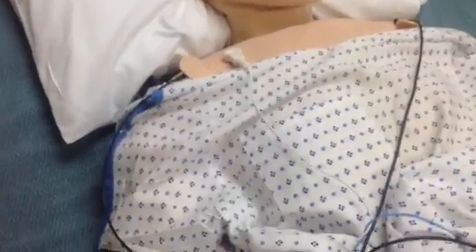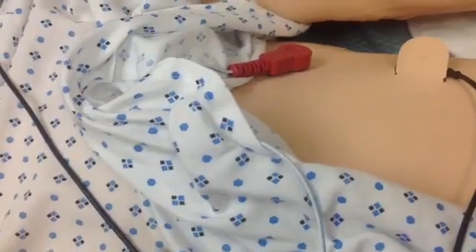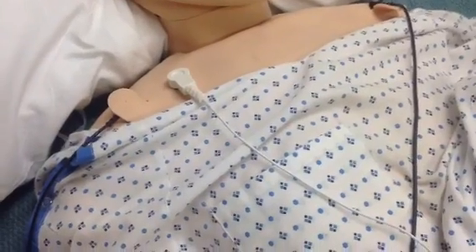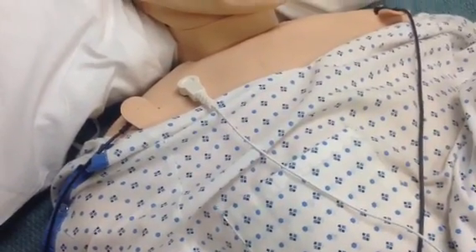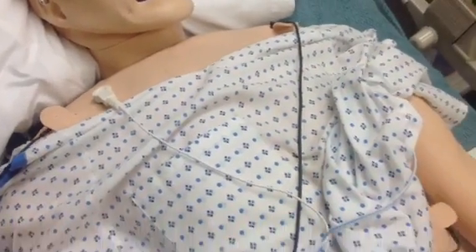And then you'll see there are another set of cables that are white and red. Those are like the pads that you would put on your patient out in the hospital, but because we've got an electronic mannequin here and he needs some specialized care, we've got some special adapters that are going to be our pads for use for defibrillation, cardioversion, or pacing in this case.